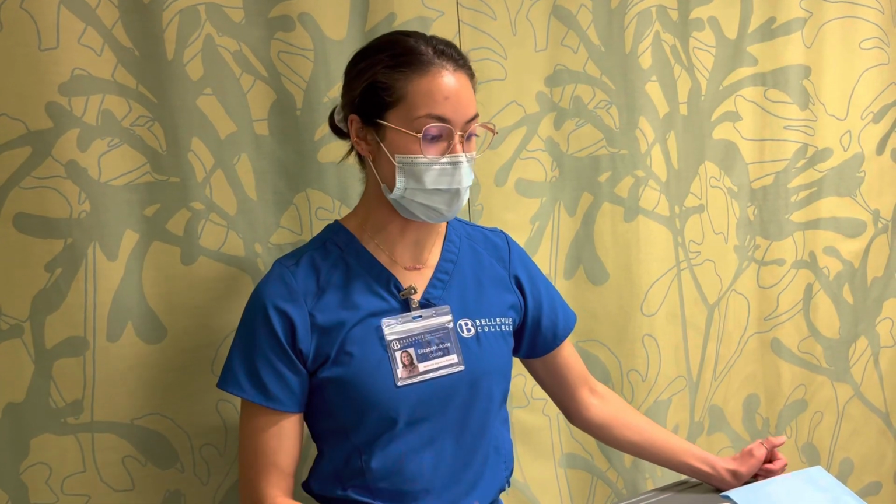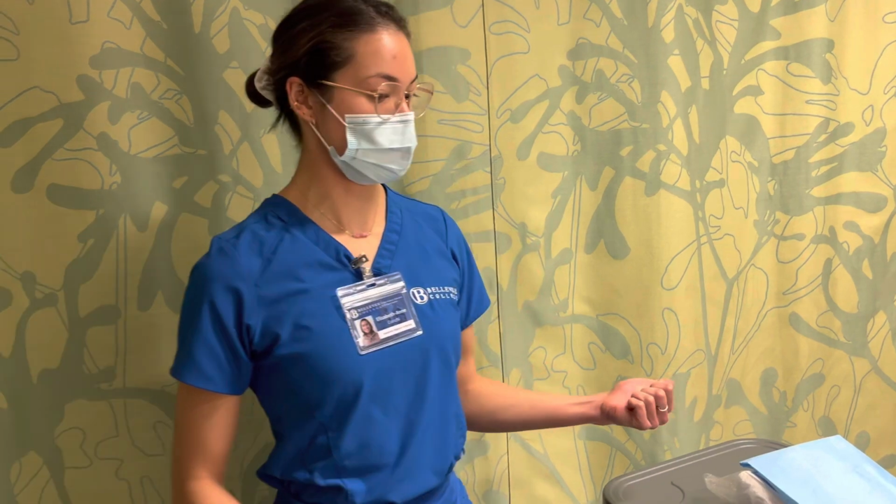So we have pre-medicated our patient about 30 minutes prior for the patient's comfort, and we've also provided peri-care, so the patient is clean and ready for their catheter insertion.